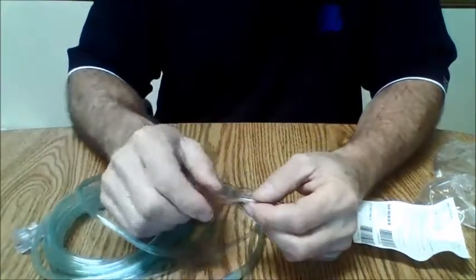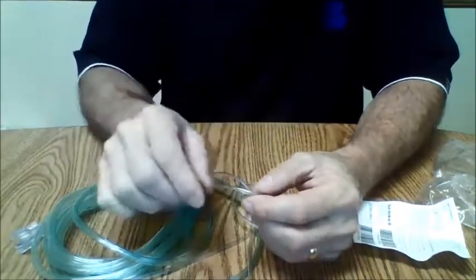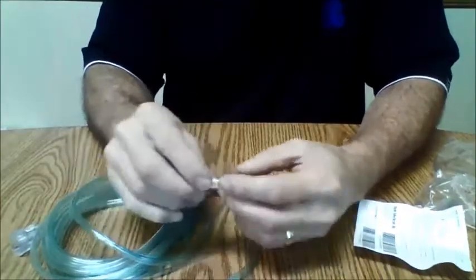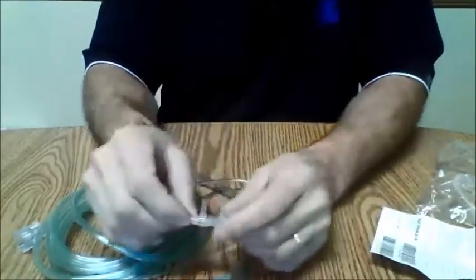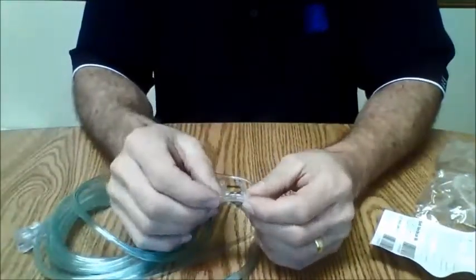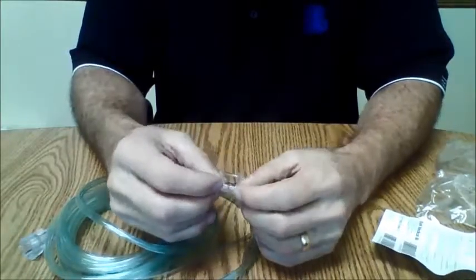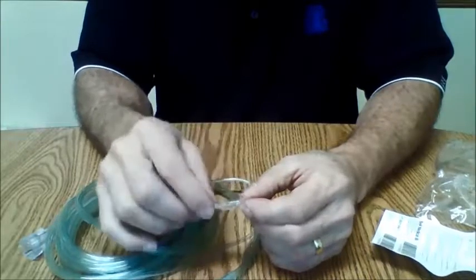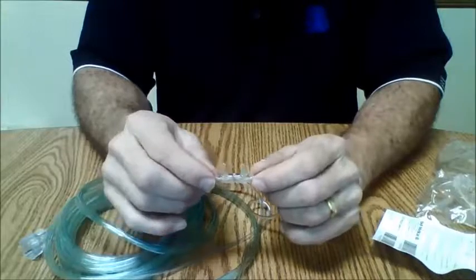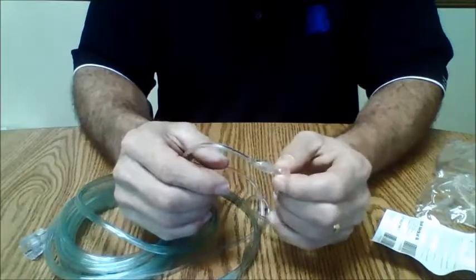Where that's important is when you put that around the ear and you cinch it up underneath the neck, it basically stays in place, whereas the harder tubing will pop out, and then next thing you know, this underneath the nose gets placed off to the side, and you get an alarm when you actually don't have any reason for an alarm. Now, we do have other cannulas that are not split, that might have a hole down here and a hole down here that will deliver oxygen and sample CO2 from the nasal cannulas. But for right now, it seems like the industry standard and acceptance is to have a split cannula where one is dedicated to oxygen, one is dedicated to monitoring CO2.